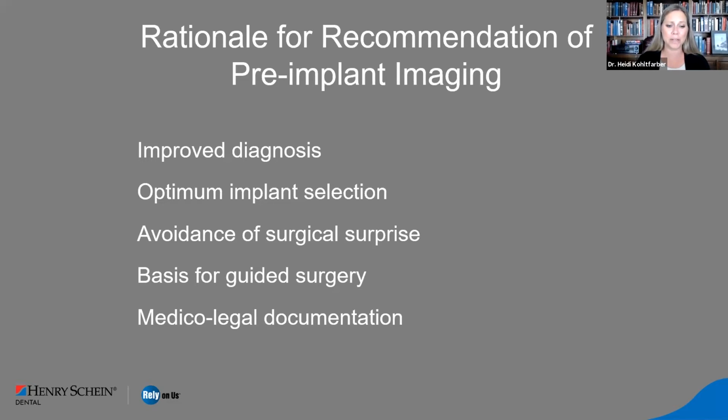As I said, I am in California, and it is a very highly litigious society here. So we have seen a lot of legal cases where there's great concern if anything were to go wrong with the placement of that implant, if there is not 3D imaging beforehand to document exactly how everything looked like, that can pose a problem for us. And so we're seeing, we wouldn't say standard of care. I would say, from a radiology point, we have not used that word. But from the legal community, we're really seeing this being pushed in a similar fashion to that.